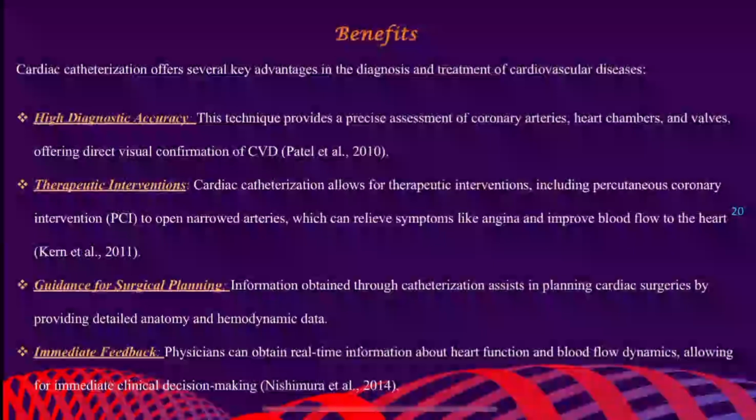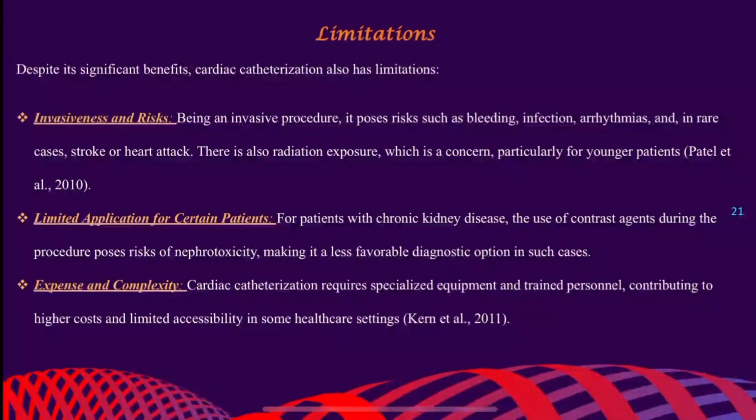Guidance for surgical planning. Information obtained through catheterization assists in planning cardiac surgeries by providing detailed anatomy and hemodynamic data. Immediate feedback. Physicians can obtain real-time information about heart function and blood flow dynamics, allowing for immediate clinical decision-making.